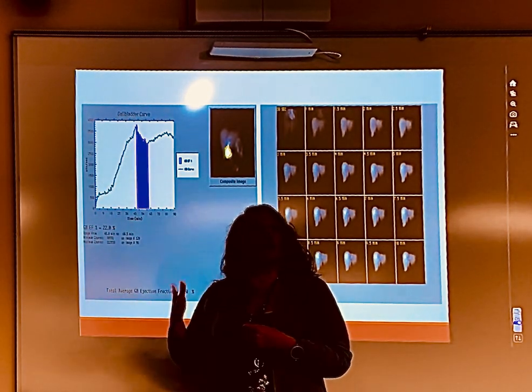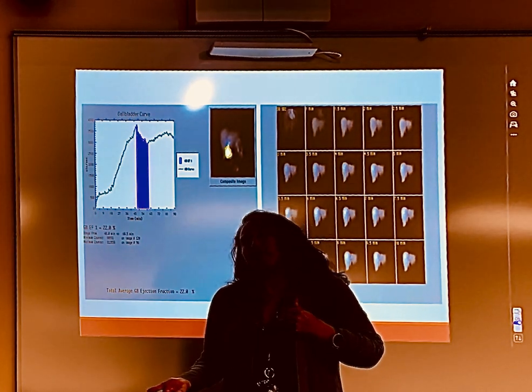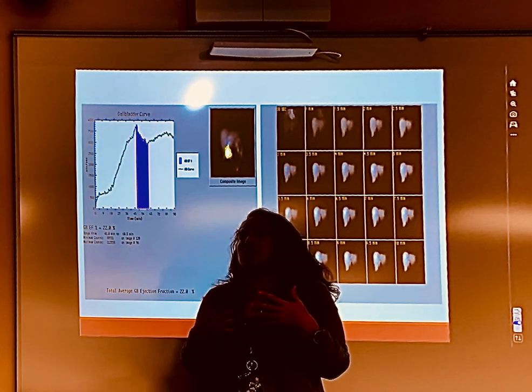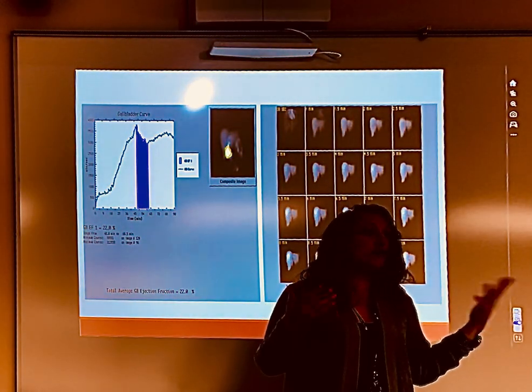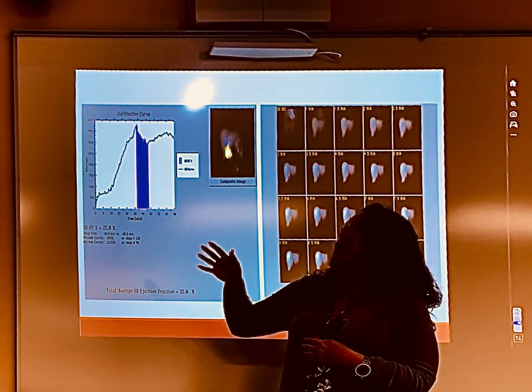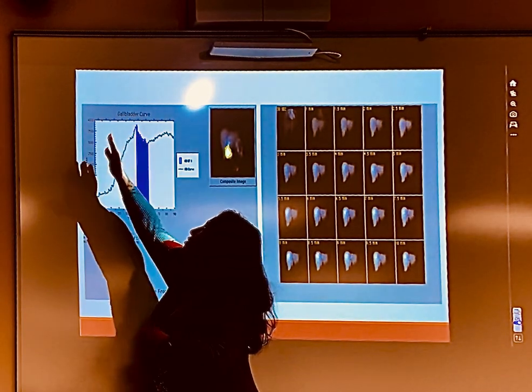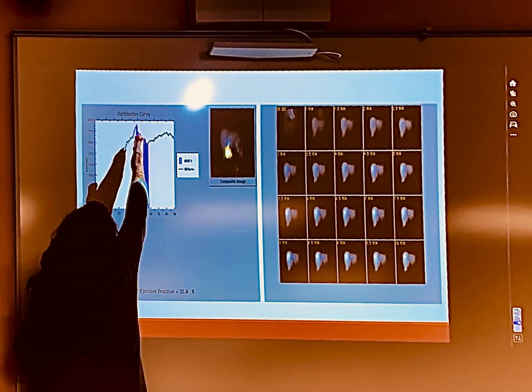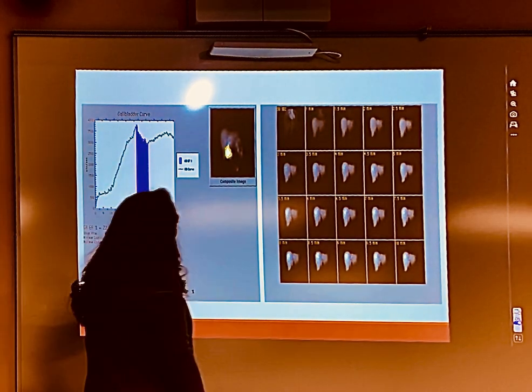Normally what you do, or what at least I've always done in my career, I take the first hour's worth of pictures and I let the patient up to go to the bathroom. You have to go pee, stretch your legs, whatever. So when you put them back on, you're going to start here. You're not going to have any of this noise back here, because you're going to start here, and this whole graph study over here.